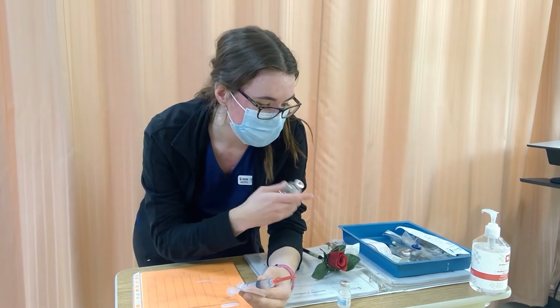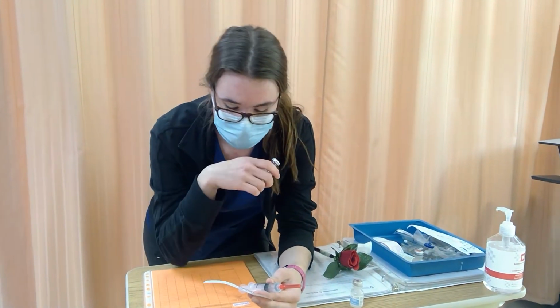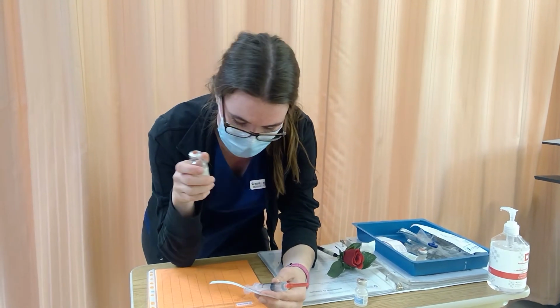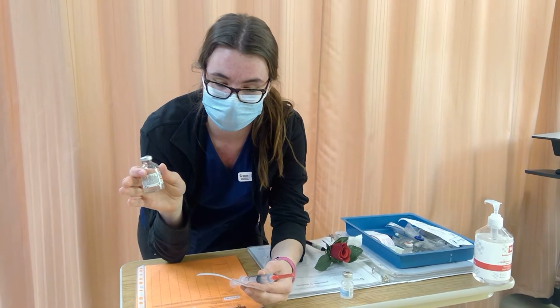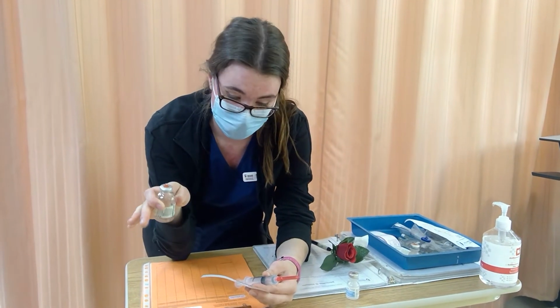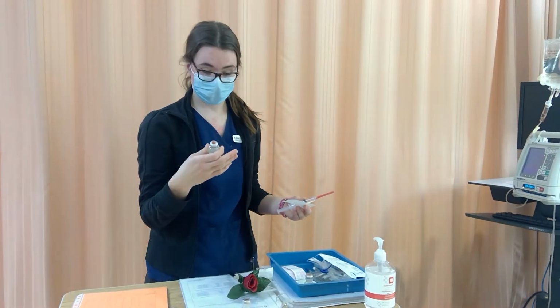So it's the correct route. It can be given IV. We're going to be inserting it in a 100 milliliter bag. And correct time, it's every 6 hours, and it's 12 o'clock, so it's due right now, so we're good as far as the time goes. I think I choked on my own saliva.